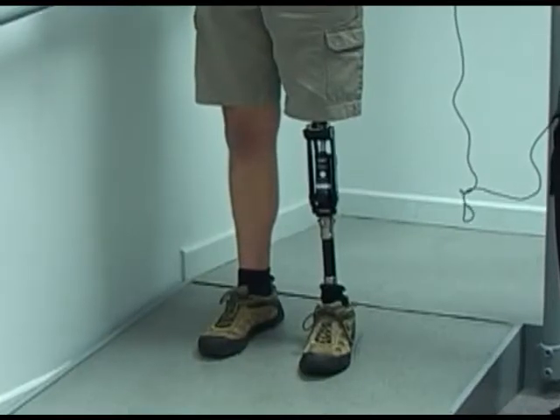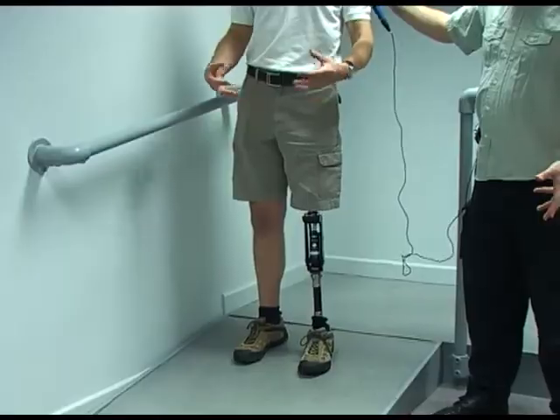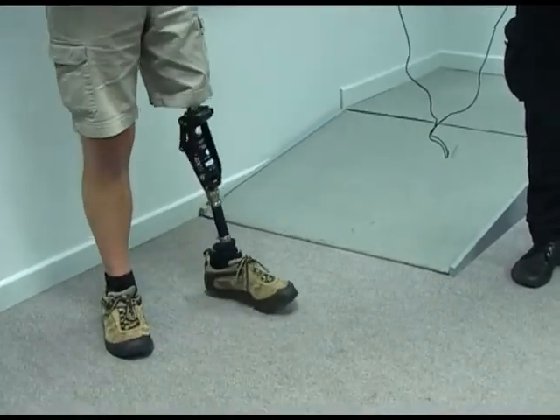So you're standing on a slope with a flexible ankle — how's that working? Well, it's helping me to stand securely, evenly loaded on the sound side and on the prosthetic side. I feel secure, I can stand upright and talk, which is great when walking down a slope with friends. You just keep going without having to think too much. With a rigid ankle you'd be thinking about it all the time — scanning the floor far ahead to spot slopes, looking for alternative routes, or avoiding them altogether. And you end up just walking along staring at the floor — who wants to do that?